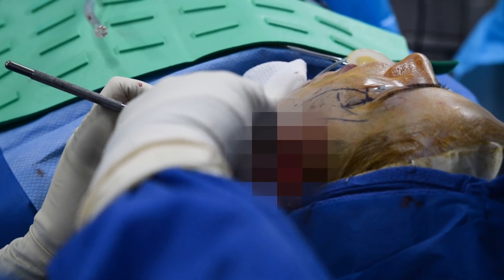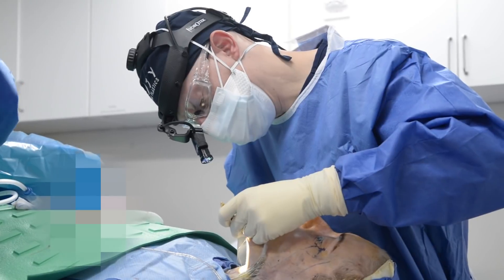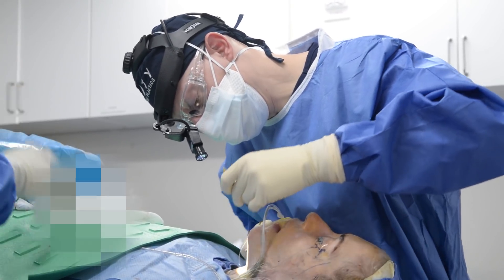We then repeat the same procedure on the opposite side of the face, using a drain there as well. After all that we return to the neck, stop any bleeders, close the platysma muscle with absorbable suture, and then close the skin of the neck. We'll play a video of the patient giving her immediate post-op recollection of how she feels.